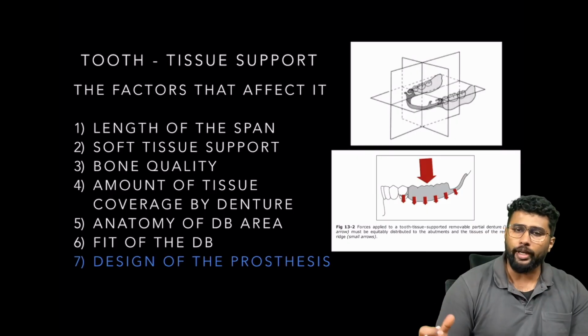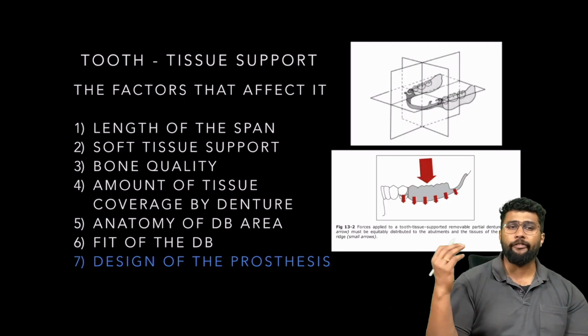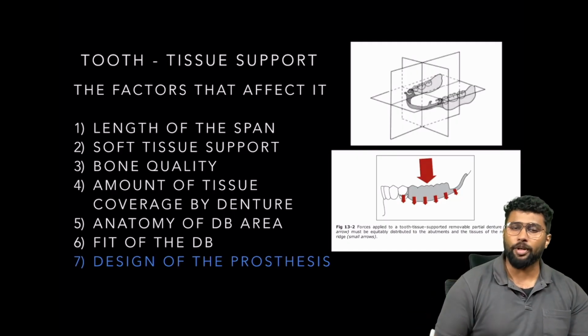However, if the fit is not great, you might end up having to repeat, or in fact, the patient might not even be able to use the prosthesis. And finally, of course, the design of the prosthesis itself.